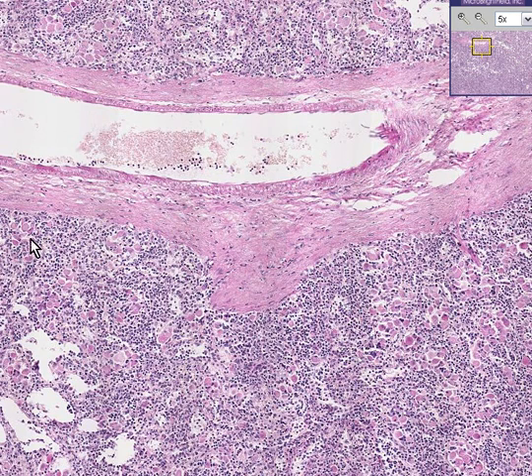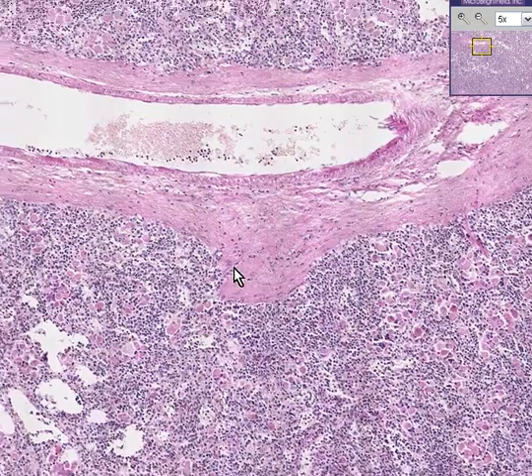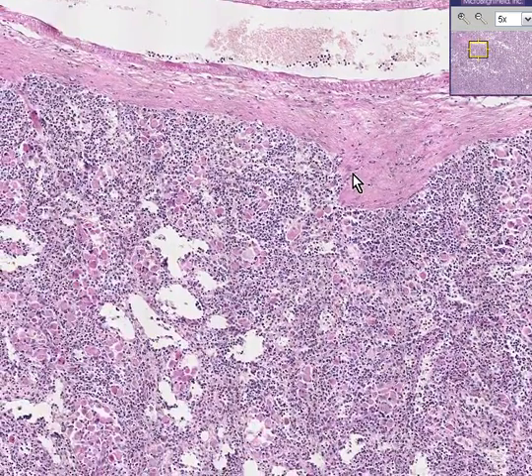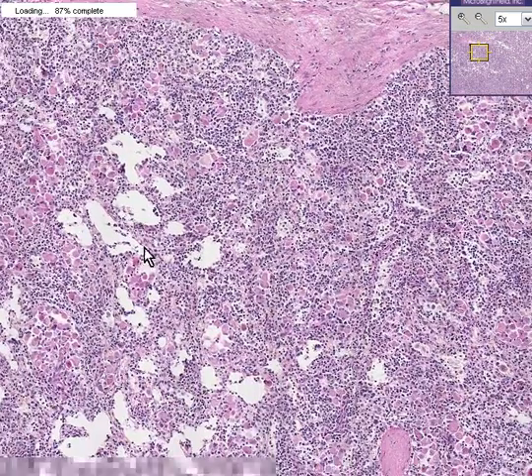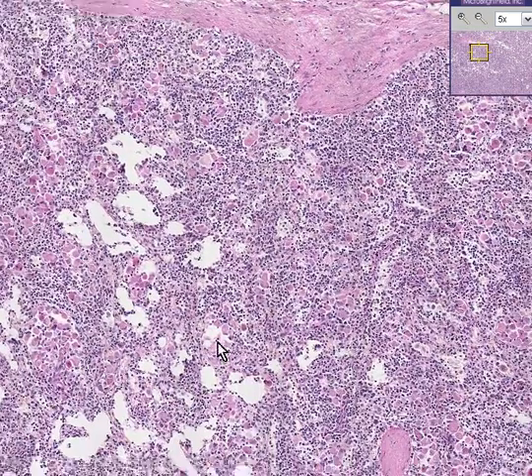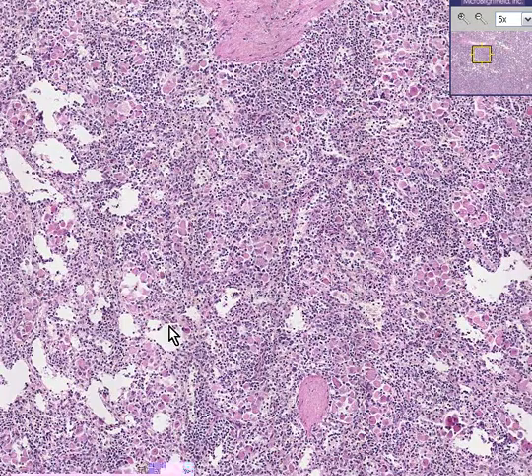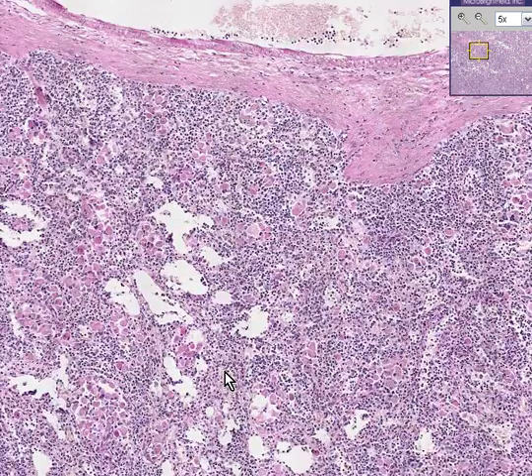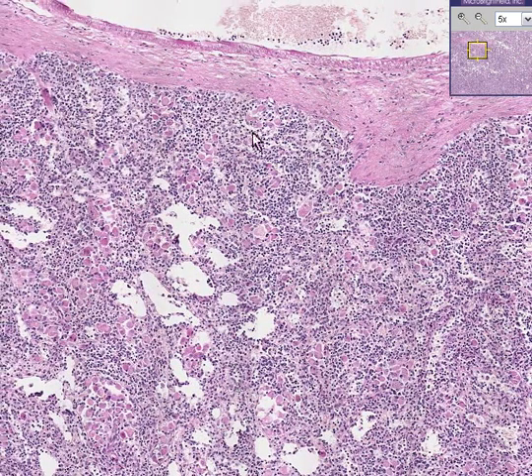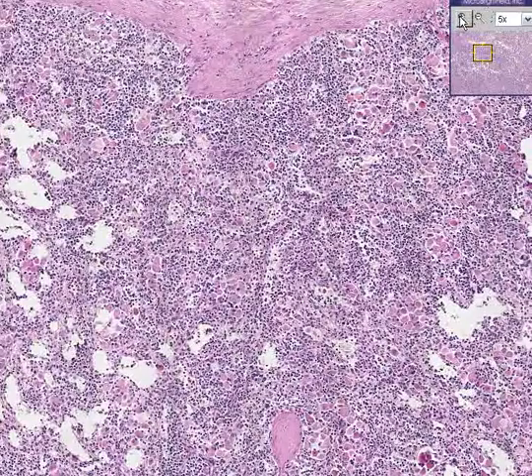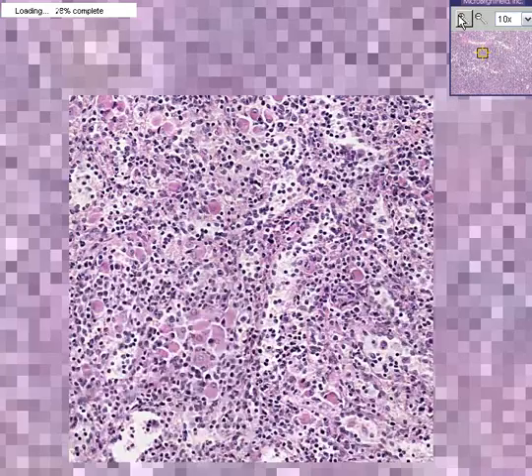The tissue is surrounded generally by lymphoid tissue, but also has the sinusoids so classical for the spleen. This would be the white pulp, and this would be the red pulp. But in addition, what is wrong with this spleen?